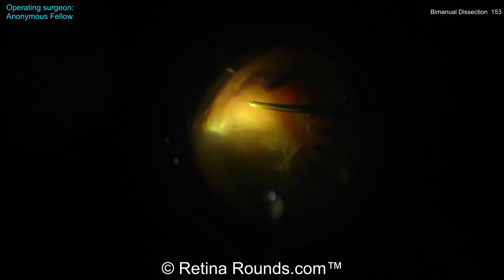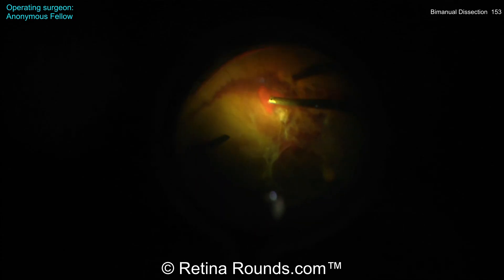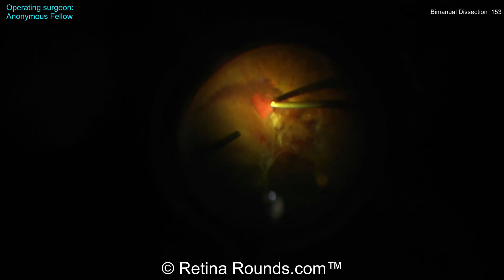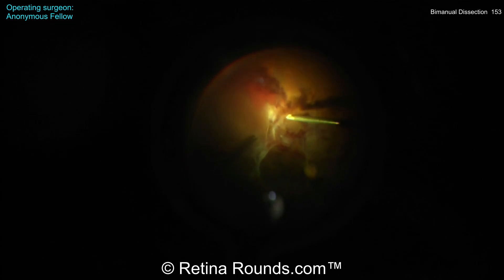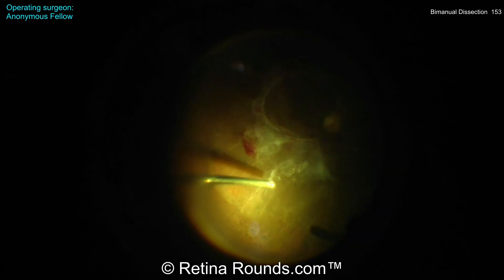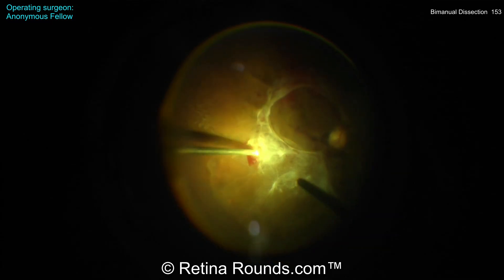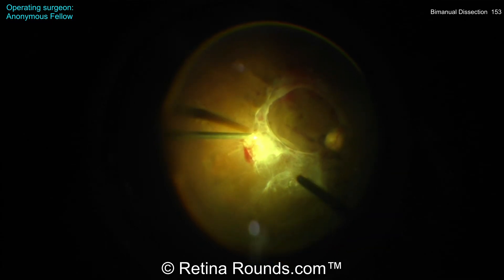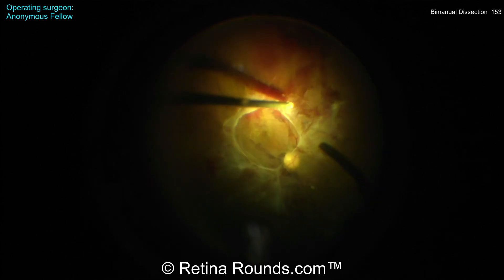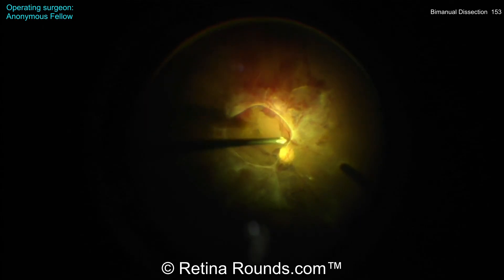Identifying the correct surgical plane is critical for cases of proliferative diabetic retinopathy. The dissection needs to take place right at the vitreo-retinal interface, where the posterior cortical gel and the underlying retina meet. That can be challenging to identify since diabetic vitreous can be highly syneretic, and there can be multiple layers of vitreous. Segmentation has been performed and now the surgeon is trying to use the cutter to identify the proper surgical plane.